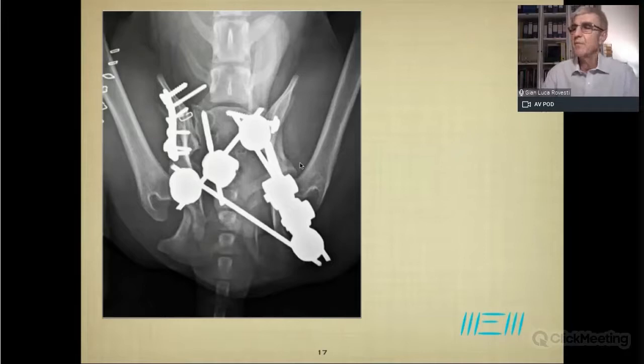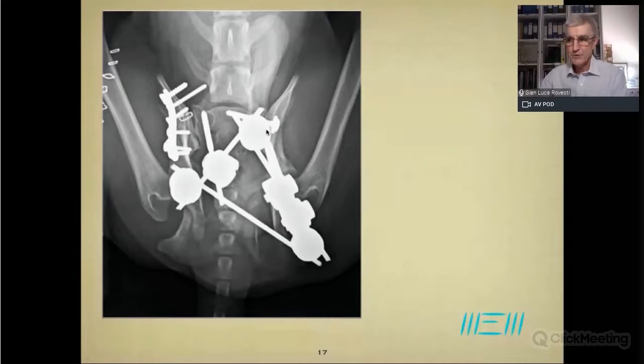So we perform this osteosynthesis of the right ilial wing, okay? Here we perform stabilization of the luxation of the left sacroiliac joint. And here, as you can see, we put an external fixator, but instead of putting on the previous landmarks that I commented on, since here we have the problem of the fracture area, and here we have the problem of this fracture line on the sacral process, joint process, we decided to put this threaded pin on the process of the sacrum, okay?